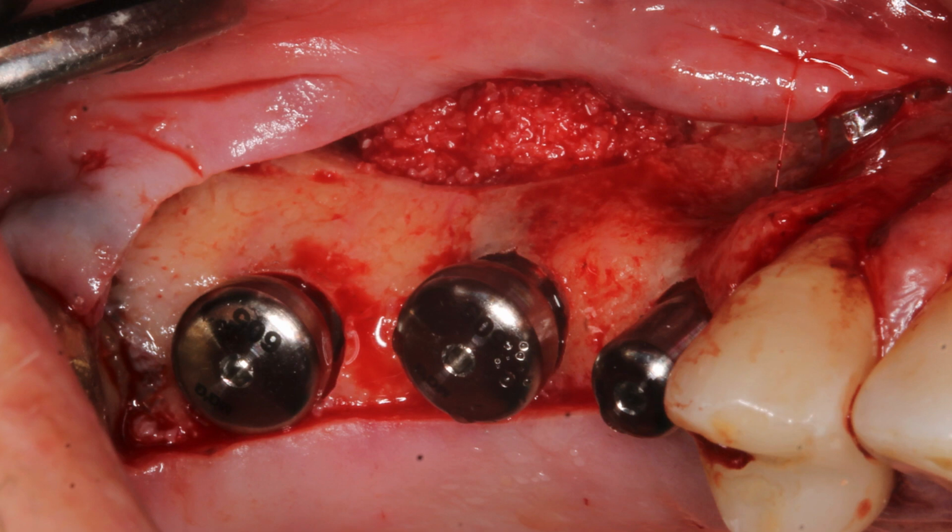In the molar areas, the wider the platform that we choose, the wider the keratinized zone we create by displacing the flap edge more to the facial, which is to our advantage. But the bigger it gets, the more of a secondary intention healing we create. So it's got to be in moderation. So this one is about a 5 millimeter diameter, which is just appropriate.